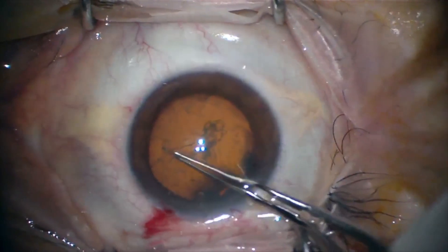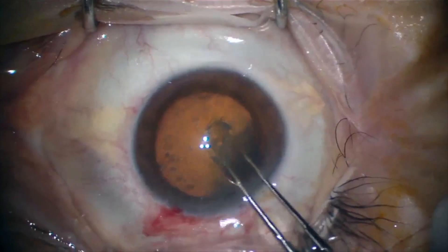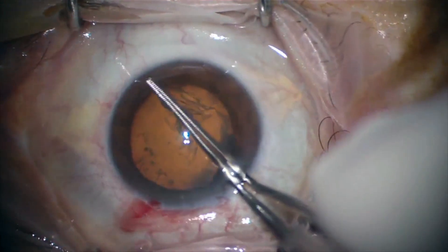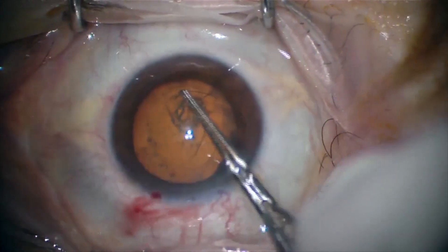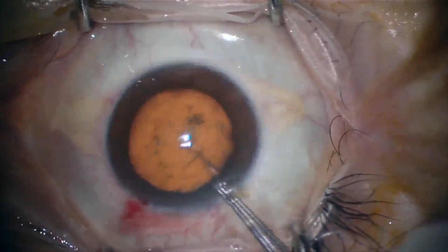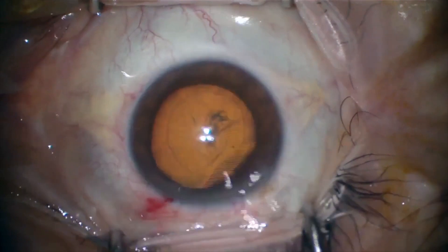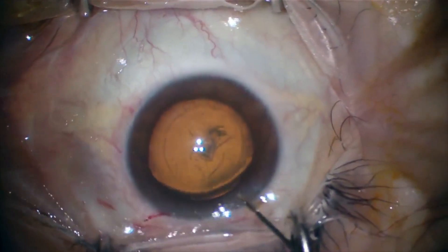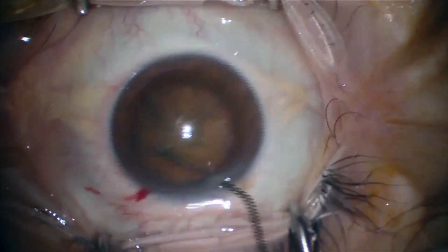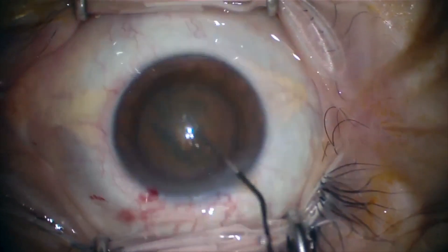We aim for a 5.5 millimeter capsulorhexis in order to place an IOL whose optic measures are approximately 6 millimeters. This is a continuous curvilinear capsulorhexis. Following this, it's important to perform hydrodissection in order to separate the nucleus from the capsular bag.